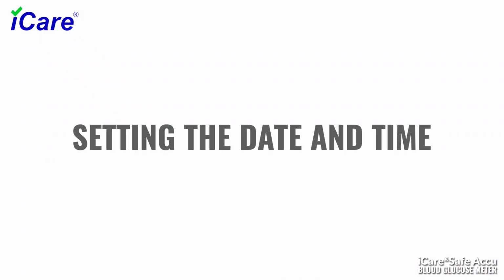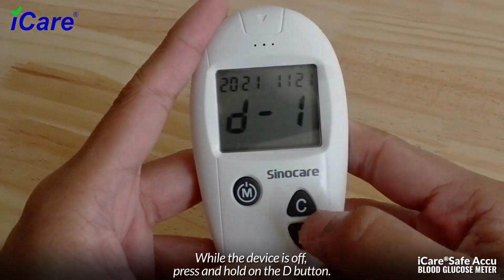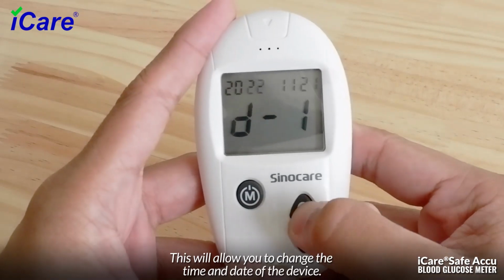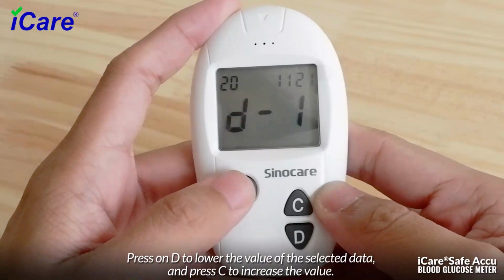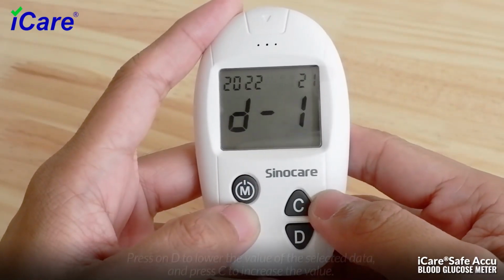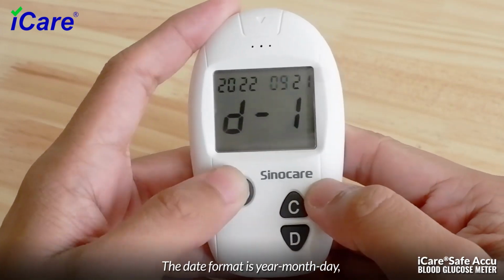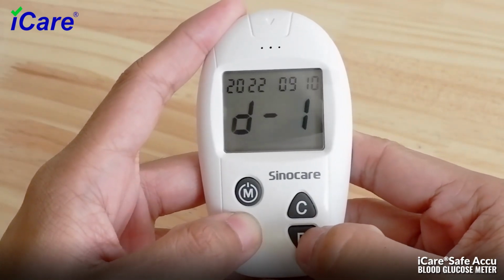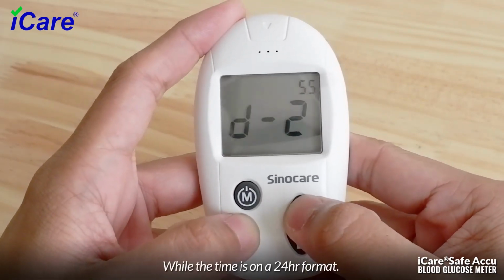Setting the date and time. While the device is off, press and hold the D button. This will allow you to change the time and date of the device. Press D to lower the value of the selected data, and press C to increase the value. Press M to set the number you input. The date format is year, month, day, while the time is on a 24 hours format.